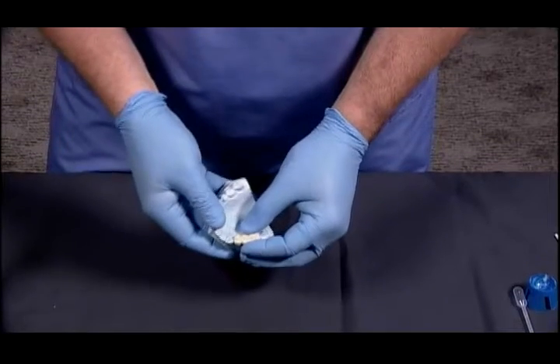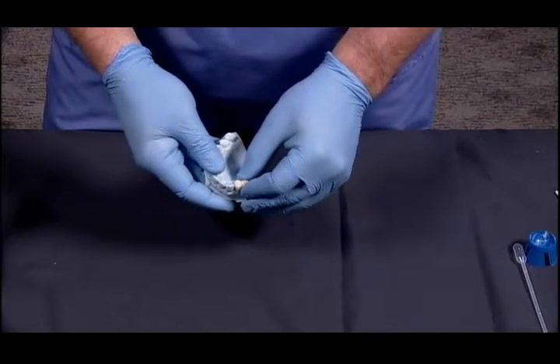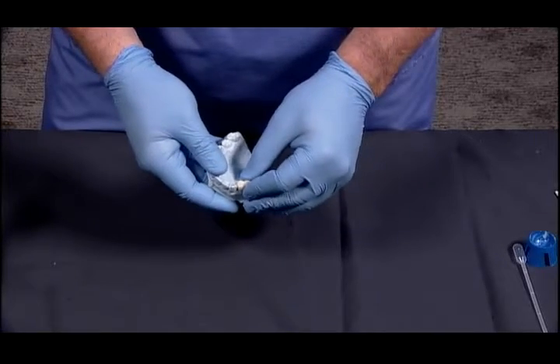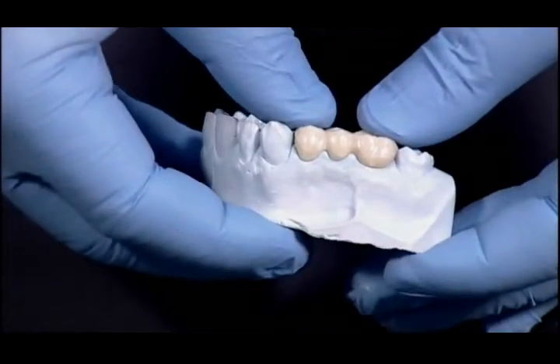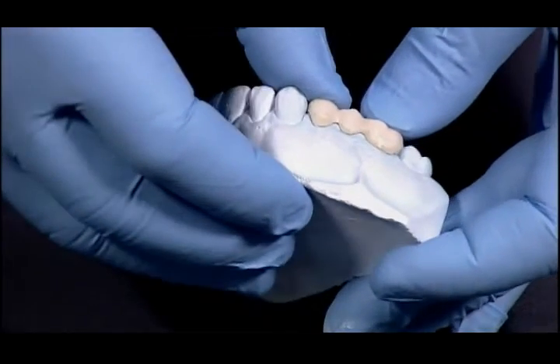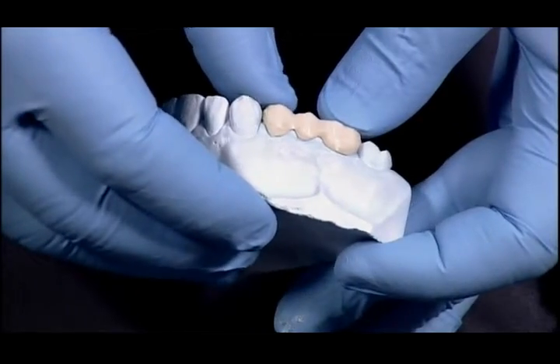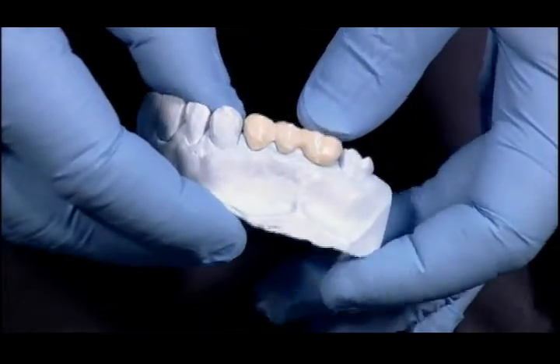Okay, we'll take the lined shell now and take it back to the lab and trim it back to its margins and make it look pretty. The final temporary restoration is delivered back to the patient. The margins are checked and verified that it is seating fully, and at that point you would place it in with a good temporary cement.